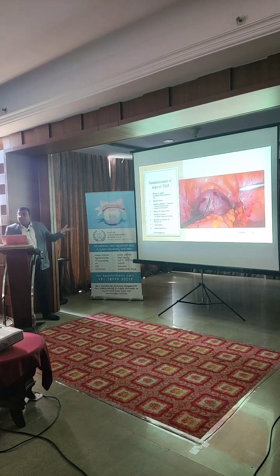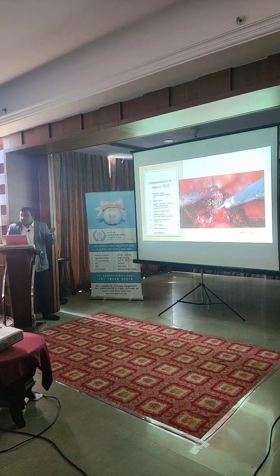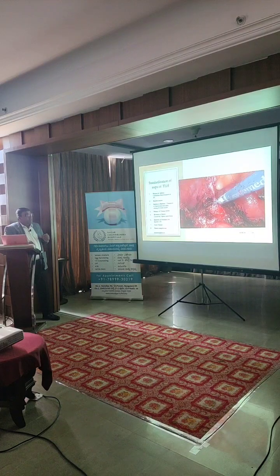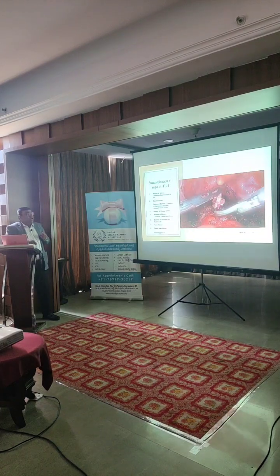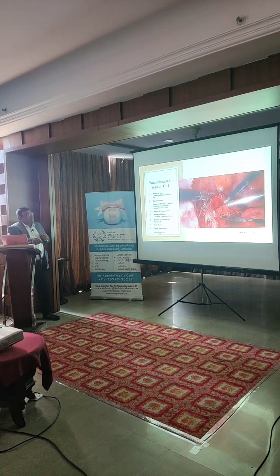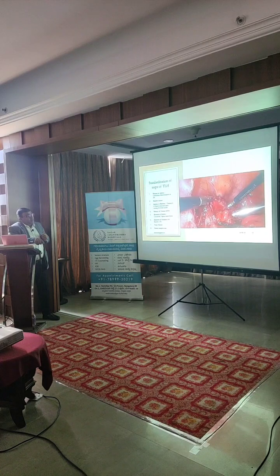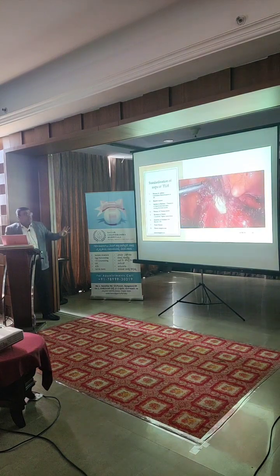Once the specimen comes out, the next step is not closure of the colpos. What we do is that all the endometriotic lesions or fibrotic lesions which can be causing symptoms to the woman are excised. Here the rectal nodule which was incised is removed. Next the rectal adhesion to the vault is also released, and then you have a nodule in the uterosacral ligament, which is also excised.